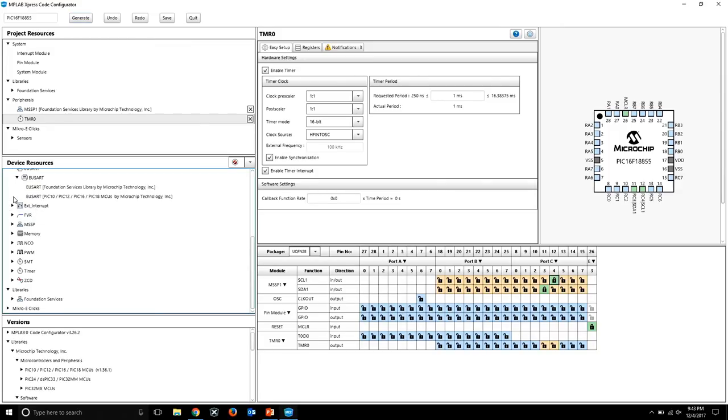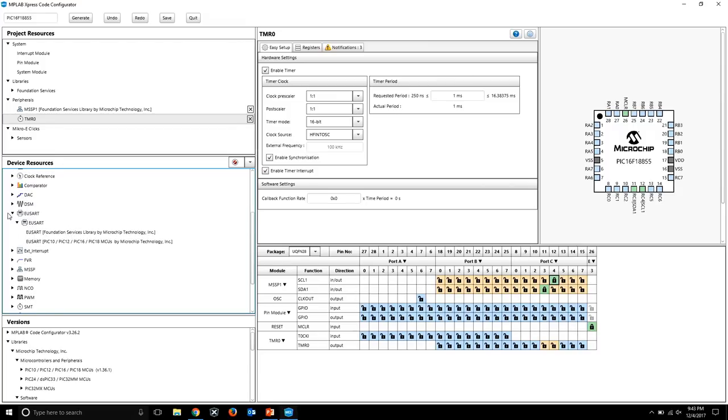So I am going to expand the EUSART module, and you can see there are two different ones that show up. What happens is we have the foundation services, the smart tool running in the background, which depends on the click boards we're using and different types of peripherals. The other one is the PIC10, PIC12, PIC16. That's the one we're going to use. That's the best practice. If you use the other one, it will probably still work, but the best practice would be to use the one that is available for us.